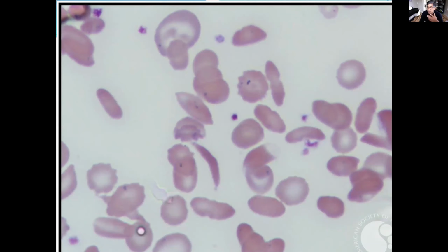Neelakantan, Dr. Balaji, all of you are right. Sickle cell. The sickle cells, that's all I know. I don't know if it's anemia or not. And of course, this is a bite cell right there. Sometimes you see bite cells in sickle cell too, when the spleen gets smaller and smaller and becomes hypofunctional.